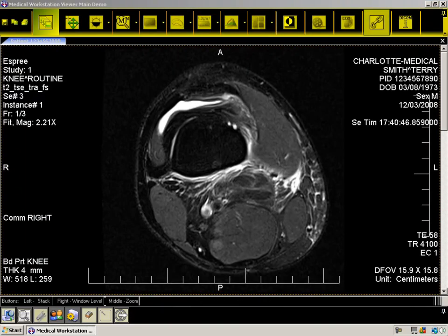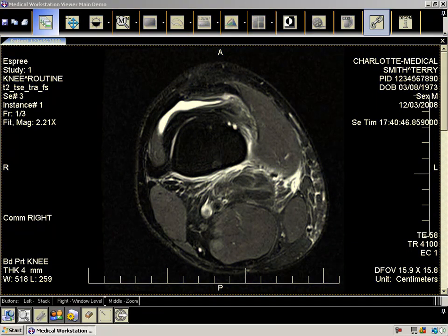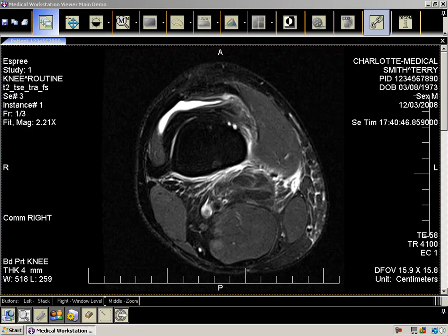At the top of the viewer, you'll notice a toolbar with many features available. In the middle, you'll see the images from the dataset you selected. At the bottom, you'll see a status bar indicating which feature is associated with each mouse button. Note that to use the zoom, you will need a mouse with a middle button. The left mouse button is the only button whose functionality will change based on the selected option from the toolbar. The right and middle mouse buttons' functionality will always remain the same.